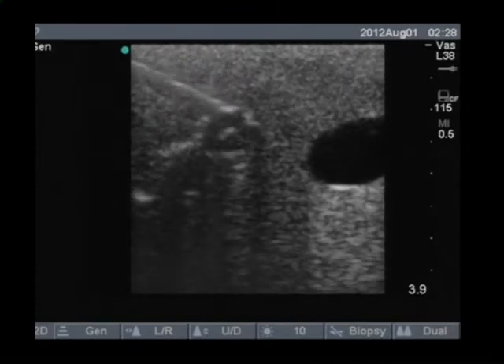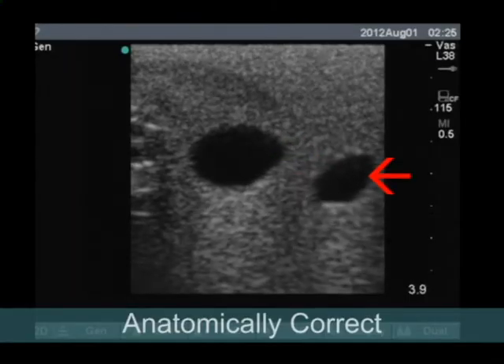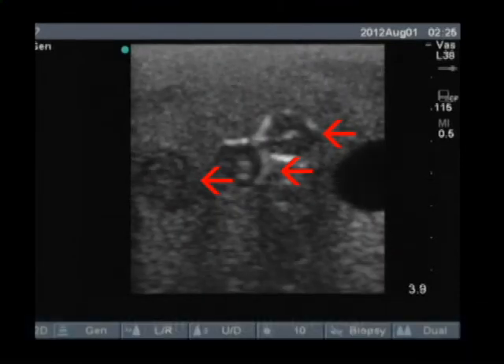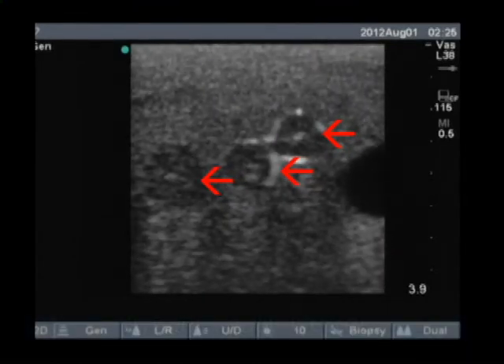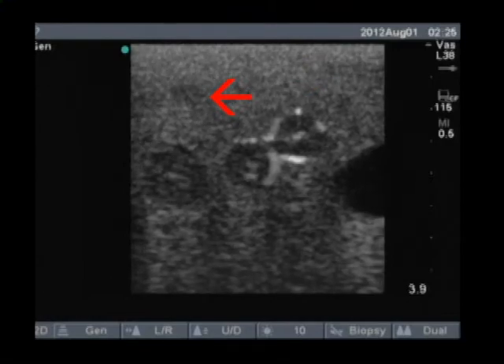The relevant anatomy is visible when viewed under ultrasound, including the internal jugular vein, carotid artery, C5, C6, and C7 nerves, the sternocleidomastoid, the anterior scalene muscle, and the middle scalene muscle.